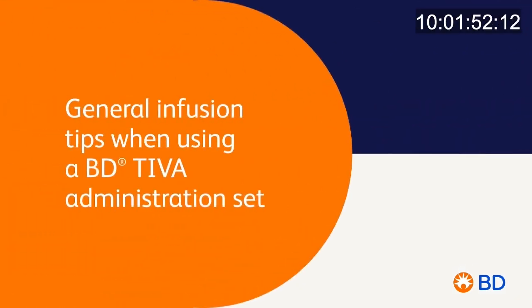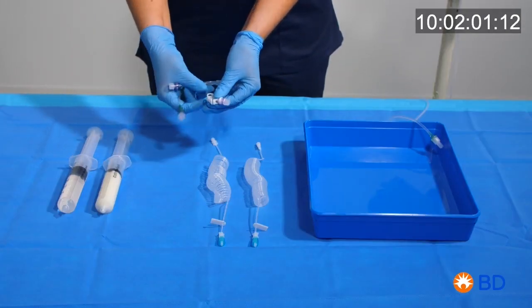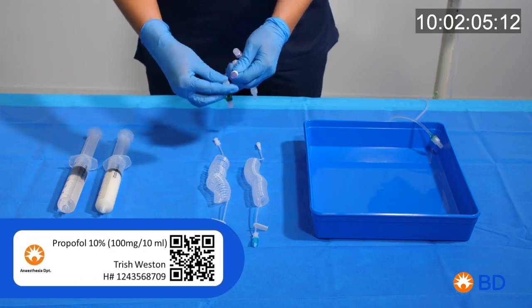Prepare the field so that you can handle and prime the TIVA set. Step 1: prime the set as shown on the video. The syringes should be labelled with the relevant drug and patient information, as displayed on the label on the screen.